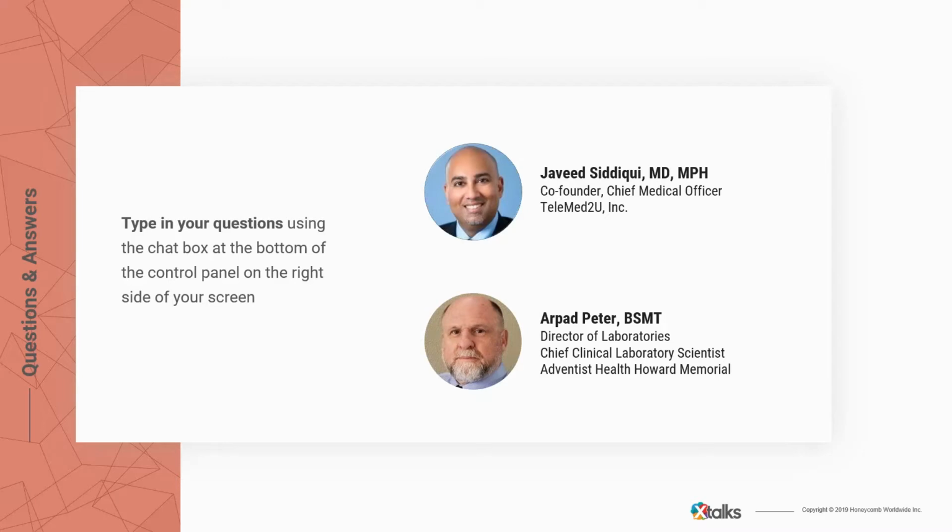Of course, I'll take that. Yes, the patient has to have signs of meningitis, right? We do occasionally have patients who come in for an LP for hydrocephalus, get a large volume tap, or come in for an LP in order to get chemotherapy. Obviously, we're not going to run that through our BioFire system. So yes, that's part of the education with the providers. Listen, we need to have concern for meningitis before we're doing this. And if I didn't say that before, that was my mistake. I apologize. But yes, we do have those criteria in place.